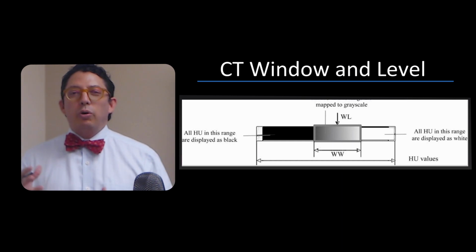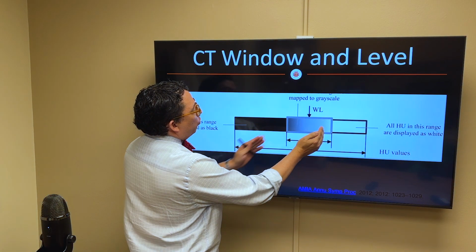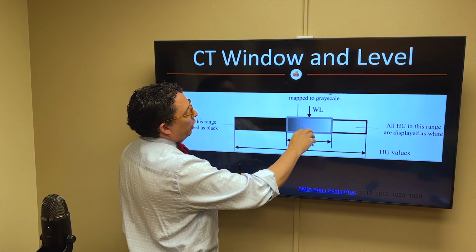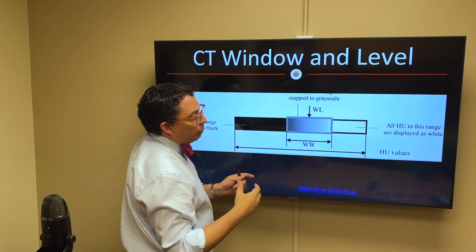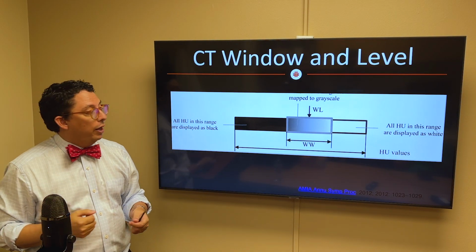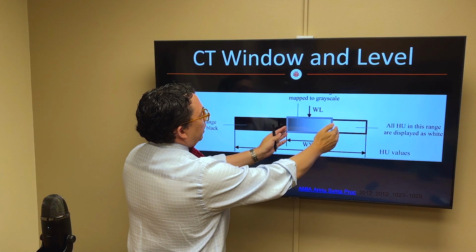Mostly when you're doing windowing and leveling, which is how wide you want the window, or the level, to be as you're displaying the images that you're watching on your PACS or in your display tool, this is where the grayscale is.